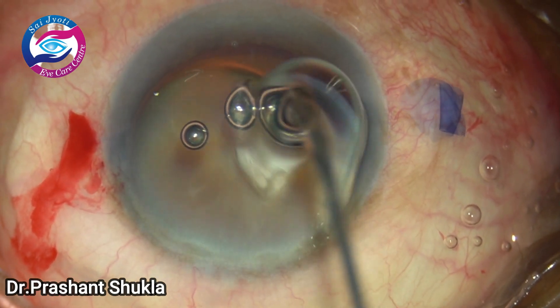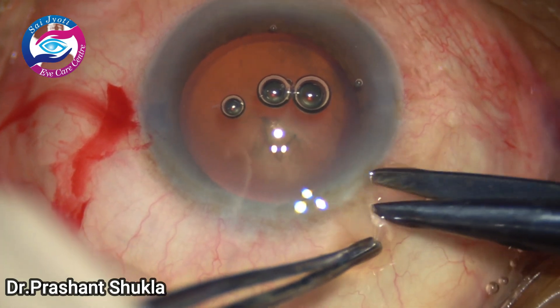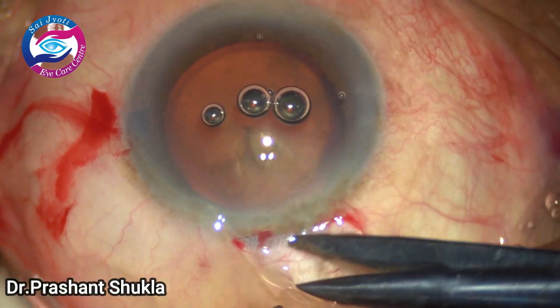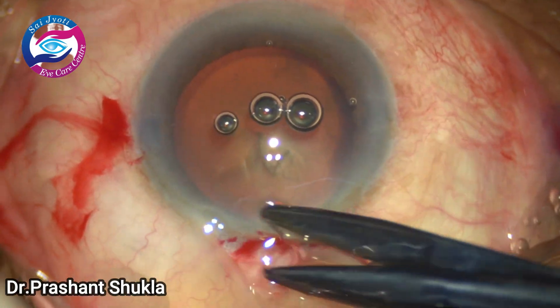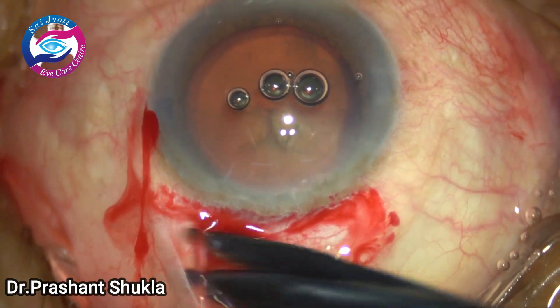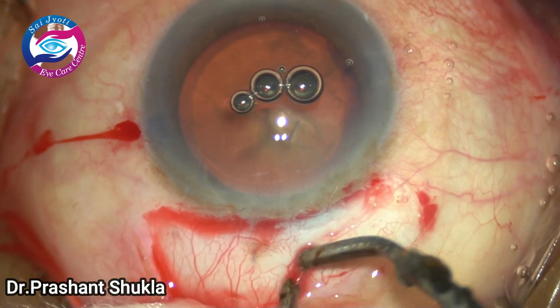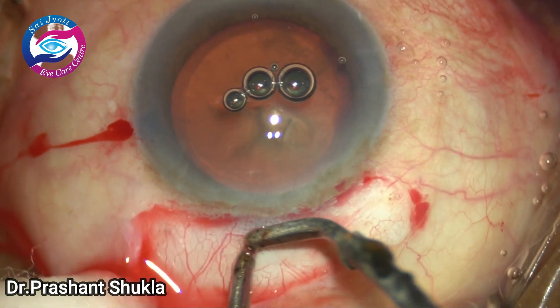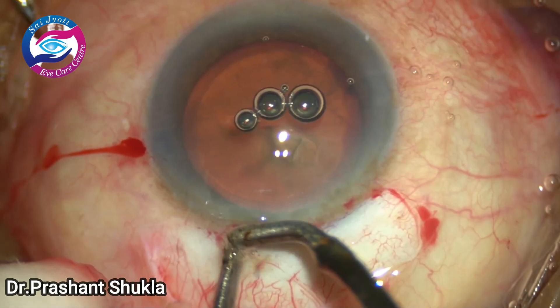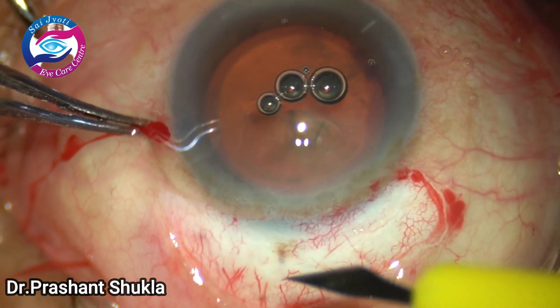By this time the rhexis has been completed and I am ready to make the conjunctival peritomy. The bleeders are now being taken care of using wet-field bipolar cautery. Just mild cautery is done because we don't want to char the sclera too much.